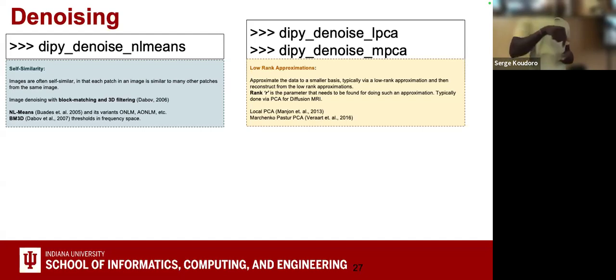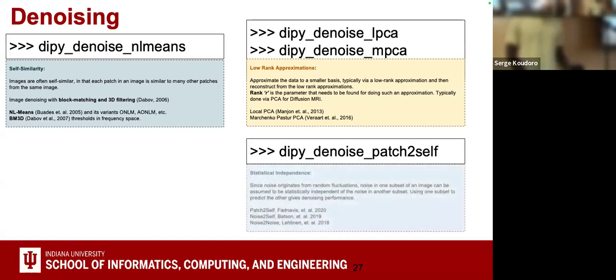And actually today, MPPCA is the most used algorithm in the field. It gives really excellent results, and people use it a lot. So I will of course recommend using it. You cannot go wrong if you go with MPPCA.